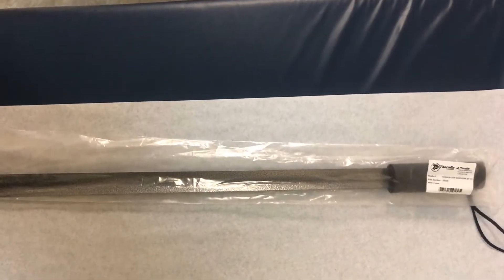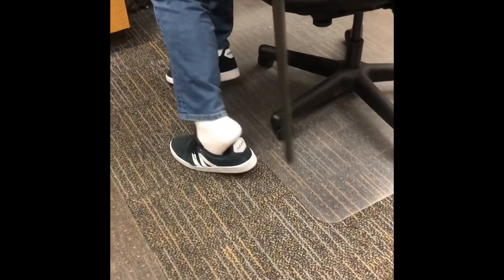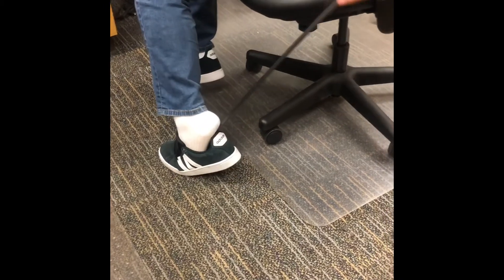The third adaptive equipment we have is a 30-inch metal shoehorn. After sliding your foot into the shoe, you're going to use the metal shoehorn in the back of your heel and slide your foot in easily.